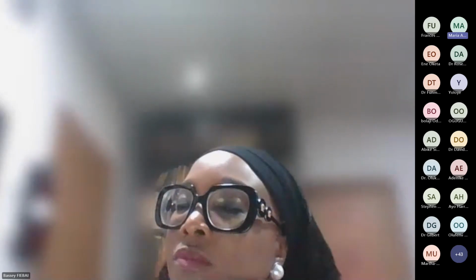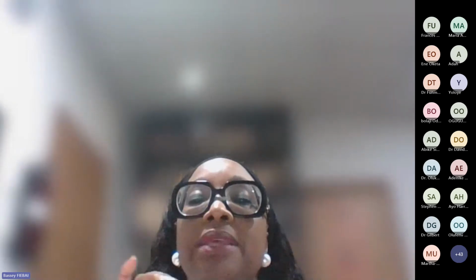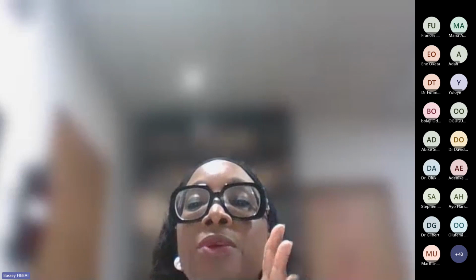Yes, because you mentioned placing the axial on the cornea. I do the probe with the B-scan with the eyes closed, with the closed lid, yes. With the closed lid, you're putting your probe in the axial one, in the primary position of gaze, right over the closed lid. Do you understand? The patient is looking in the, yes.